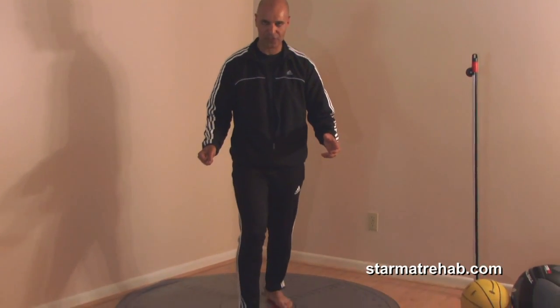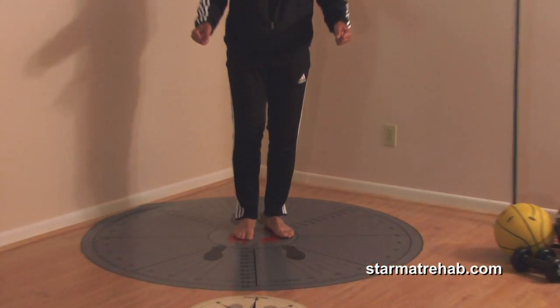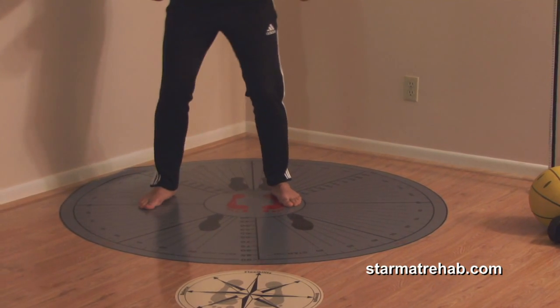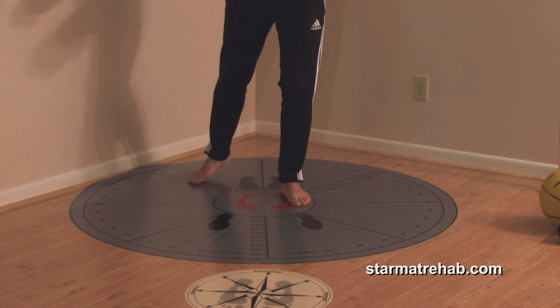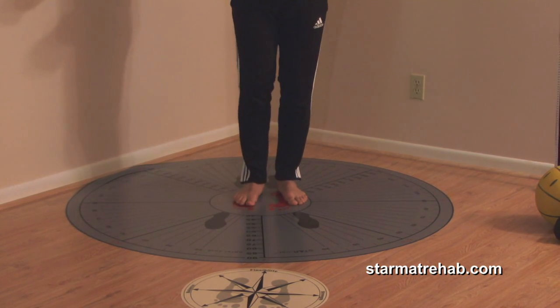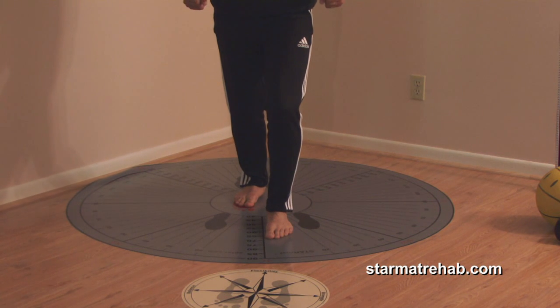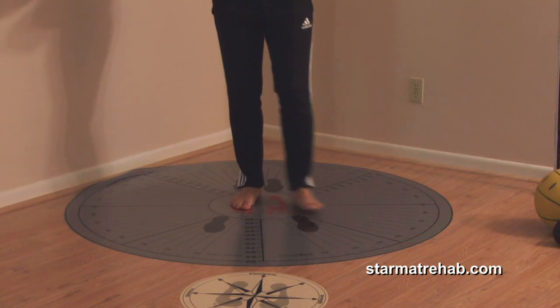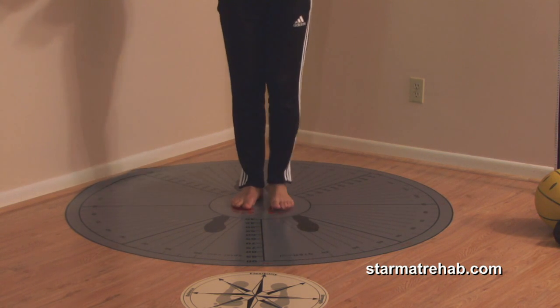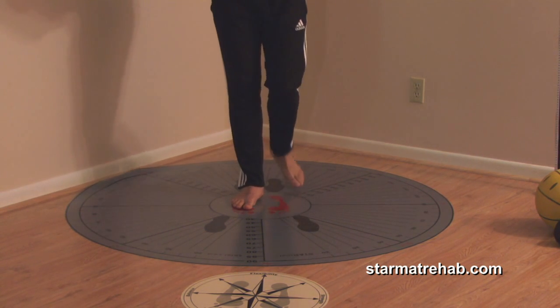The step star exercise is: you just step forward and back — anteriorly. Then anterolaterally, pretending to hold the walker, then lateral and come back, posterolateral and come back, posterior and come back. Repeat the same thing with the contralateral leg: step anterior, anterolateral, lateral, posterolateral, and posterior and come back.